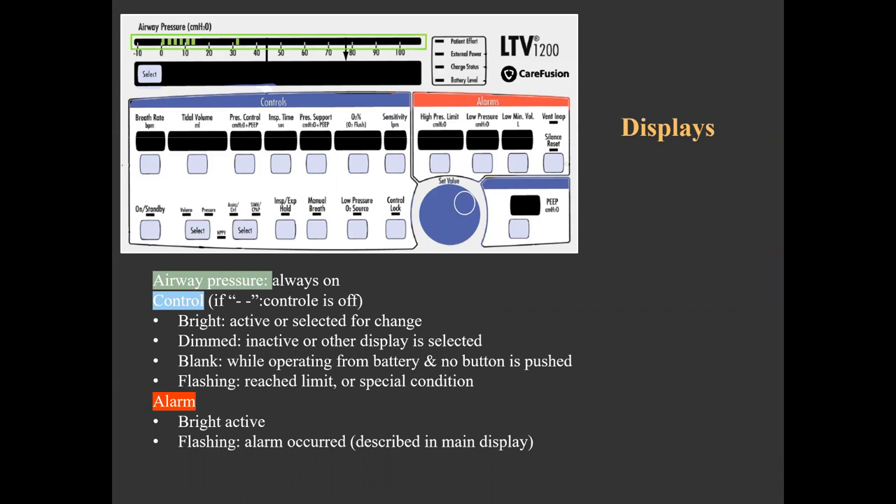The airway pressure display, highlighted in green, is a bar composed of 60 LEDs that display airway pressure variability in real time. It can also show a single LED for peak inspiratory pressure on the prior breath as an optional extended feature. The control displays highlighted in blue can be solid bright, dimmed, blank, or flashing. A solid bright display means it is currently active or selected for change, which puts all other control displays into dimmed intensity. A dimmed display indicates it is inactive in the current mode or when another control is selected. Blank displays are seen when operating from battery without selecting any control button, or when a feature like the oxygen blender is not installed. A flashing control display while toggling indicates a limit has been reached, and occasionally another related display will also flash — for example, if setting the rate conflicts with the inspiratory time, both will flash together.